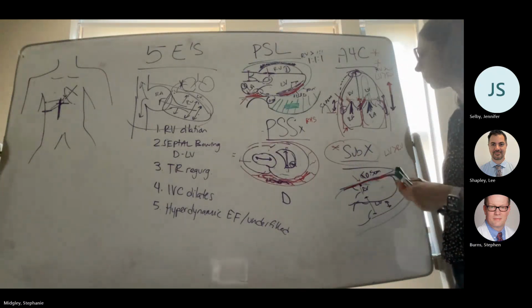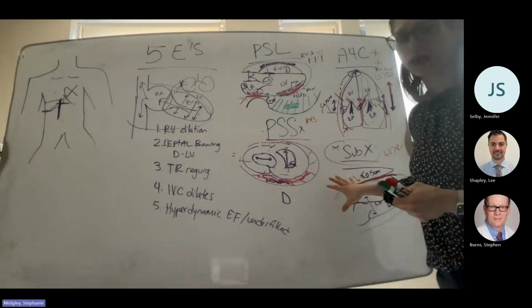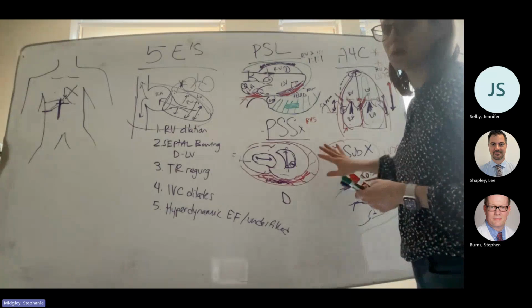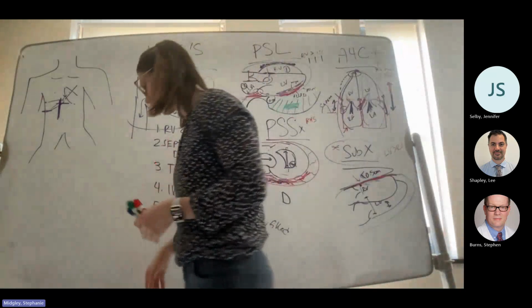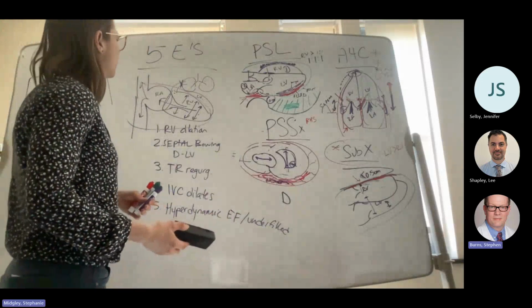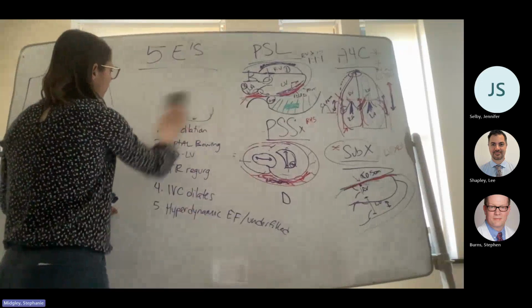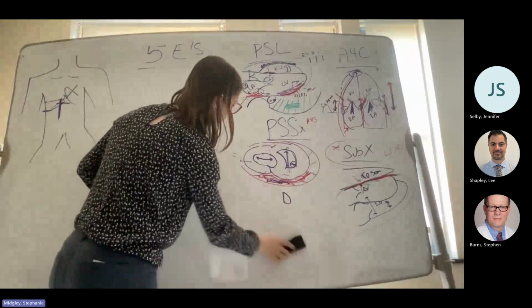Okay. Although I'm going to tell you that you can still get a PE or an MI on top of chronic right heart failure. I have definitely missed PEs in these patients because I tried to be overly academic and was like, oh, this is all chronic stuff. Then the patient came back and they diagnosed their PE because somebody was like, oh, right heart strain, let me get a CT. So sometimes don't be overly smart and just think about PE when you see right heart strain.